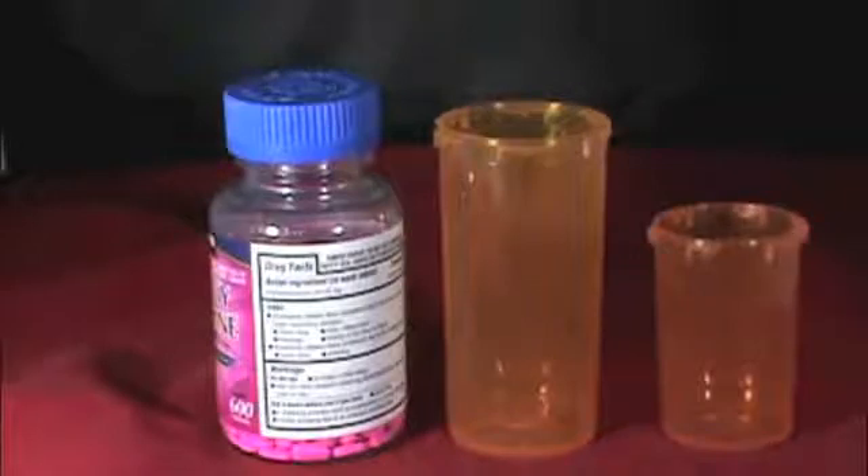To count over 199 pills, you will need, in addition to your counting vial, a container large enough to hold all the pills you will be counting.